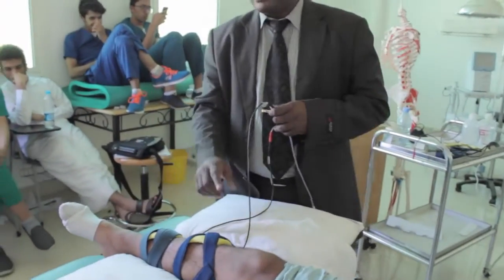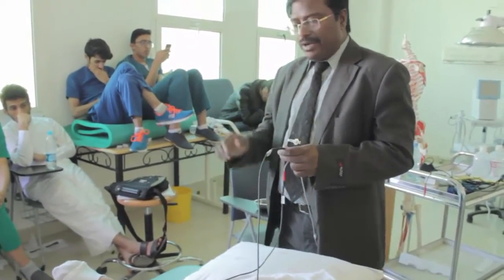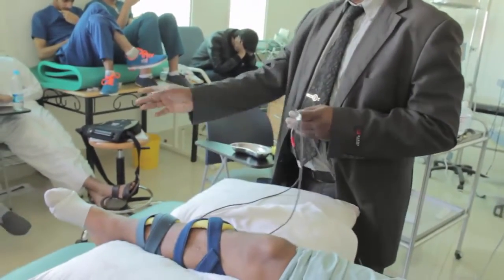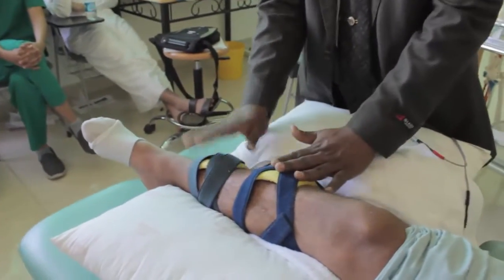Anode and cathode should be on the muscle. Preferably, the cathode should be on the motor point. For example, for dorsiflexors, if this is a major motor point, like how you read in the Faraday currents, at the motor point place there should be the cathode. On the same muscle, there should be the anode. For example, this is a big muscle, so I can keep a good gap between the two electrodes.